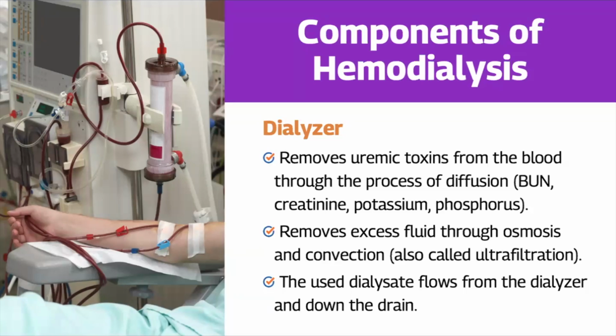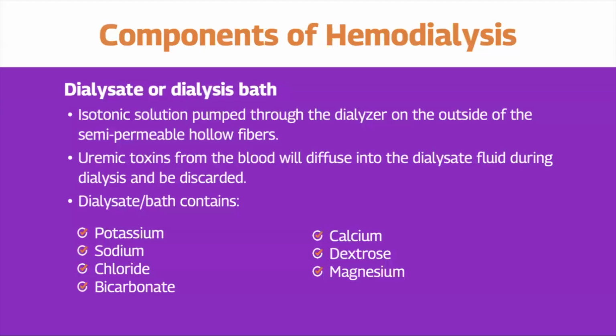We used to do a procedure that is now done without capturing the spent dialysate, but we would measure the dialysate in a beaker for this one procedure, and the beaker would fill up with fluid that came out of the patient's blood. When you saw the fluid, it was a cloudy beige color, and it had the aroma of urea or urine. So we know that's what we're doing to the patients. We're taking off those uremic toxins.